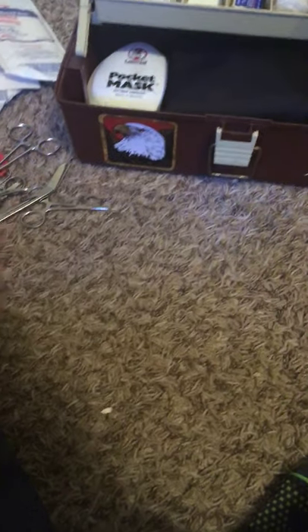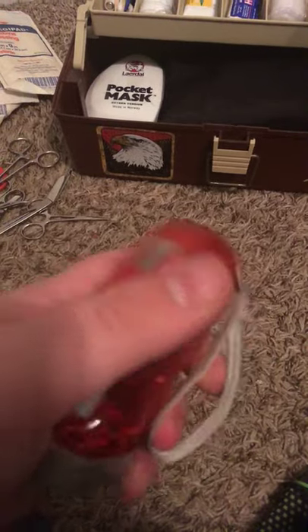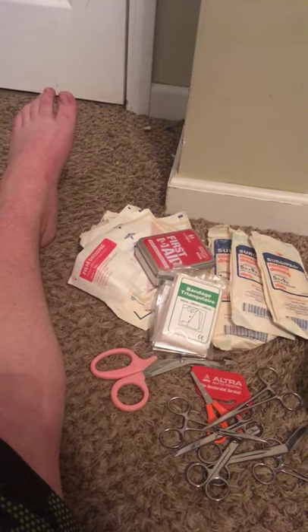Then I have an emergency blanket and a triangle bandage. And a little squeeze flashlight — it's one of those flashlights that you can just flick on, or you push this little thing down and then it opens up like that. A little flashlight.